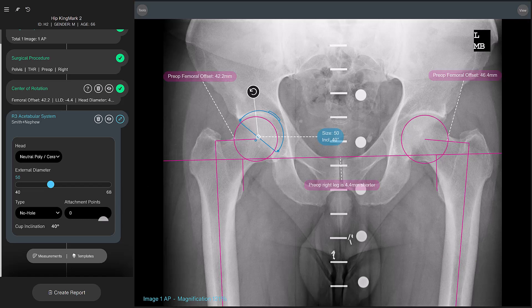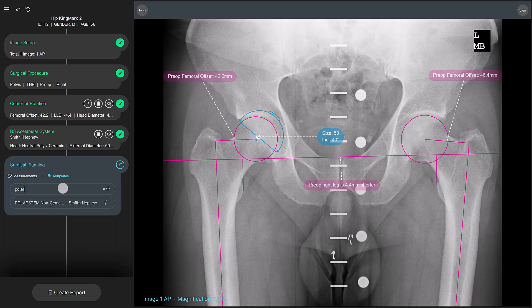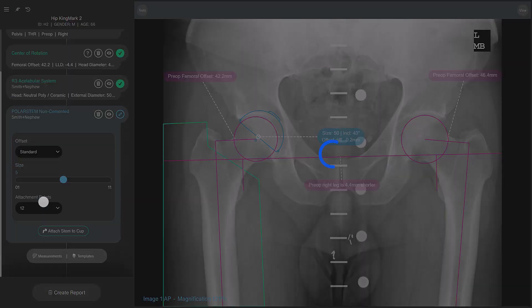Once you're pleased with the cup placement, the next implant template you should add is the polar stem. Select the templates tab on the left again and search for a different one. Once you find the correct implant, select it, and it is automatically positioned on the image in the right location and size, just like the previous one.